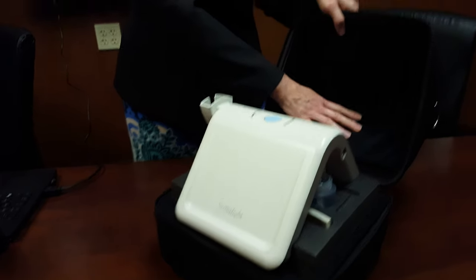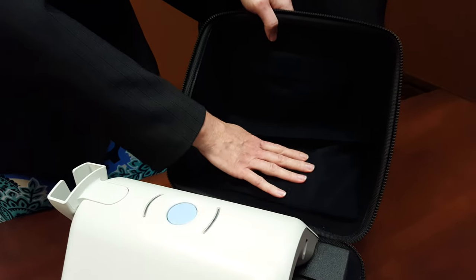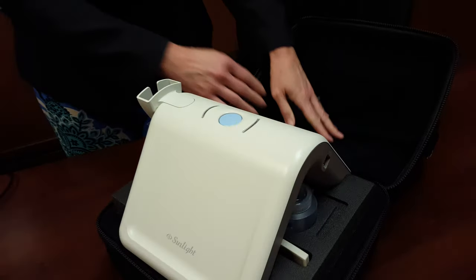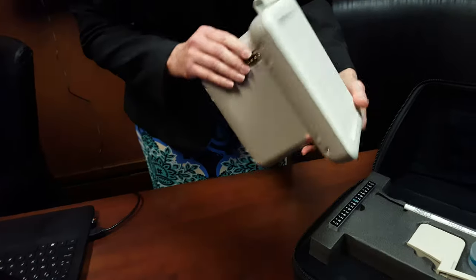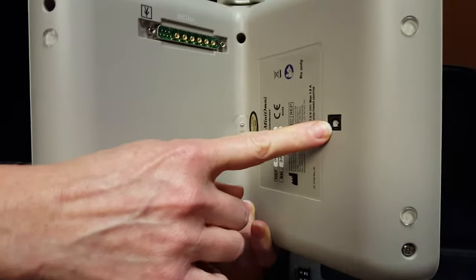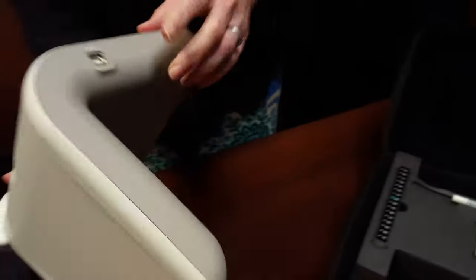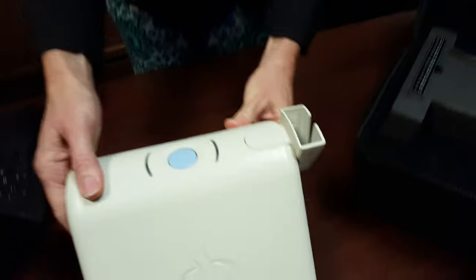You have a hidden pouch with a Velcro top that holds your user manual and your warranty card. Take the main unit out and you'll see the power cord input, where you will rest the probe, and where you will connect your USB. We'll set that down.